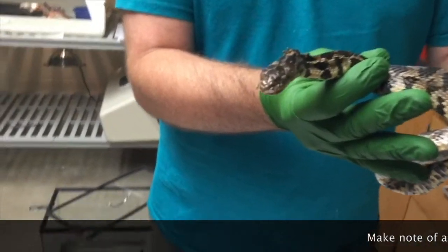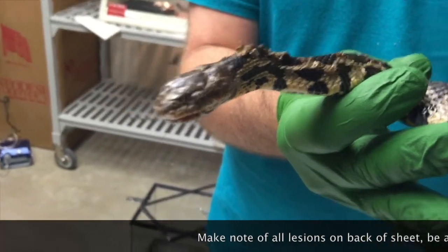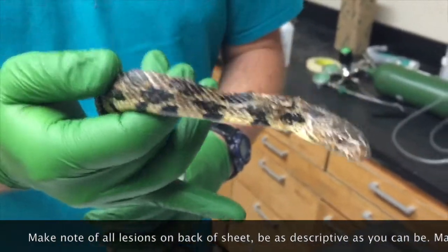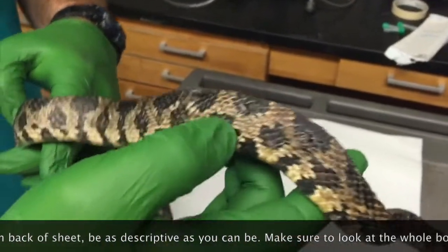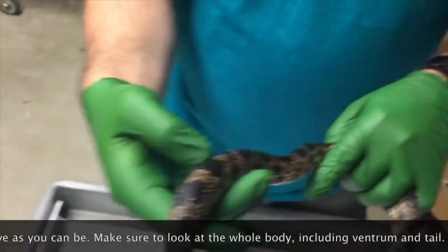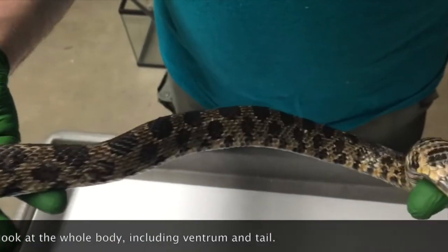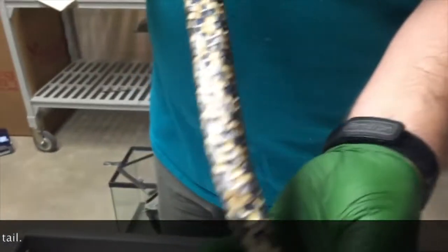Make sure to fully examine the head, neck, back, belly, sides, and tail for any raised or discolored scales, pustules, crusts, or ulcers, as you can see here in this fox snake. Lesions in this fox snake were severe. Feel free to freehand the description of the lesions on the data sheet. If there are more than 4 lesions, make a note in the data sheet and draw as many as you possibly can, but only collect samples from up to 4 lesions.